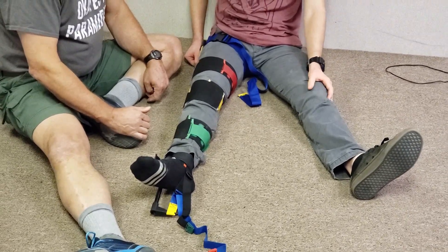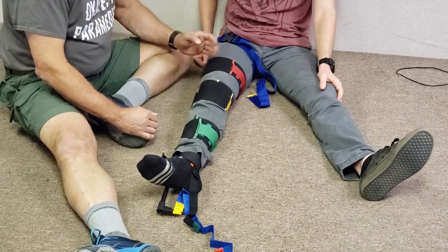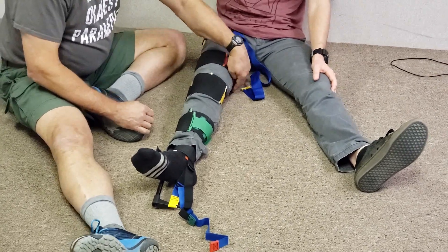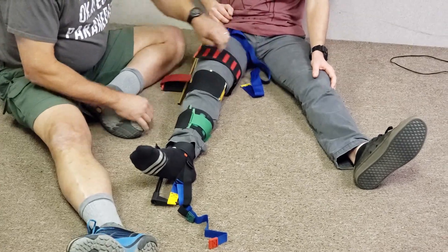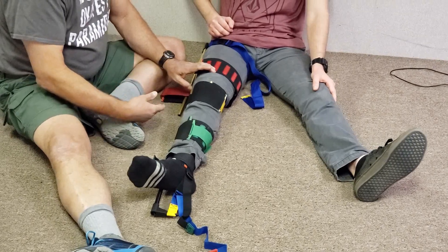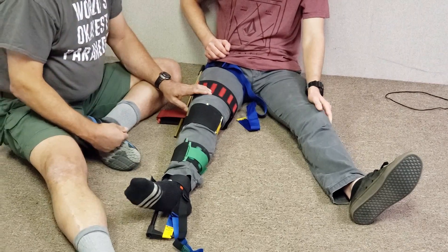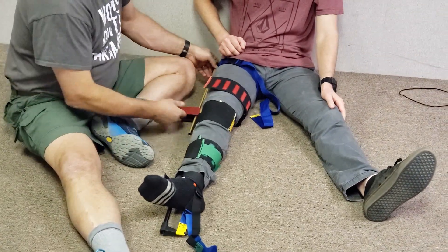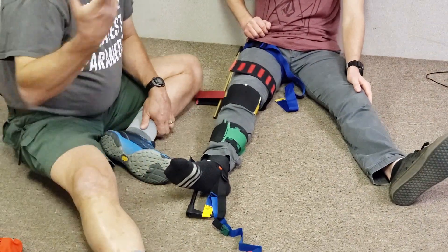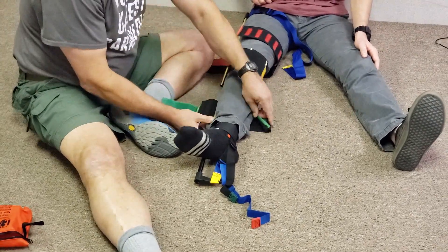As for the national registry guideline of 10% of body weight or 15 pounds — that's pretty meaningless in the field because we don't have anything to measure that accurately, even on the Sager splints. You are not treating the splint or the dynamometer. You are adjusting traction to resolve the patient's pain. Maybe in a surgical suite or hospital the poundage makes sense, but not in the field.